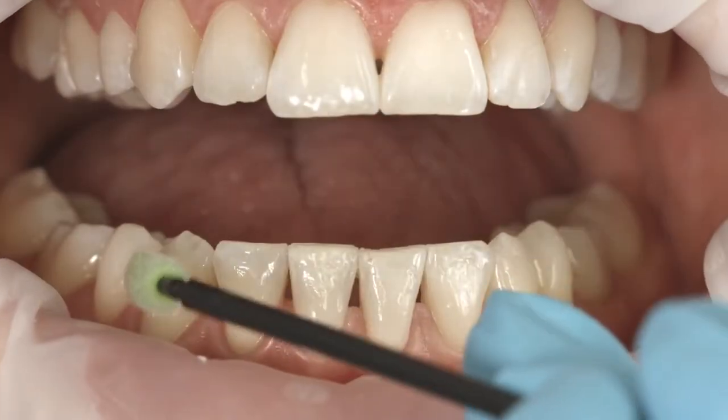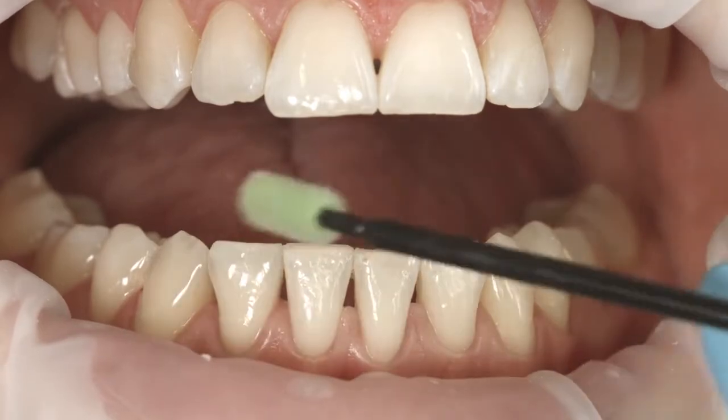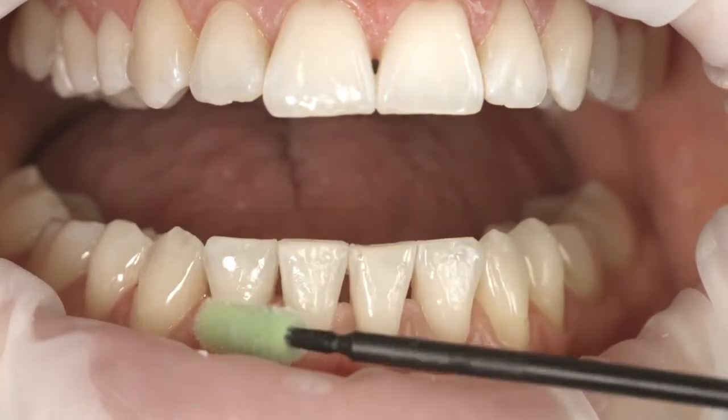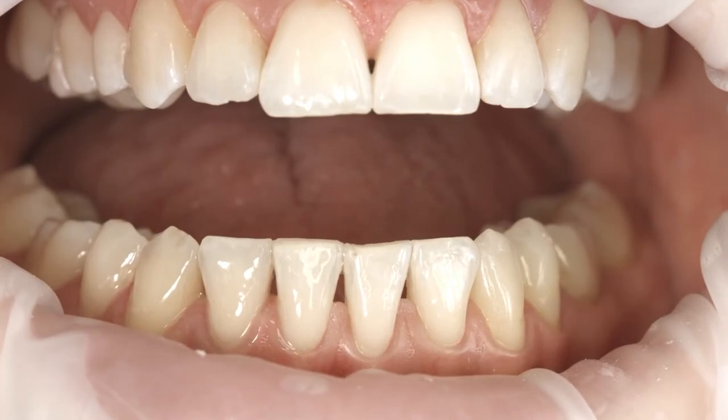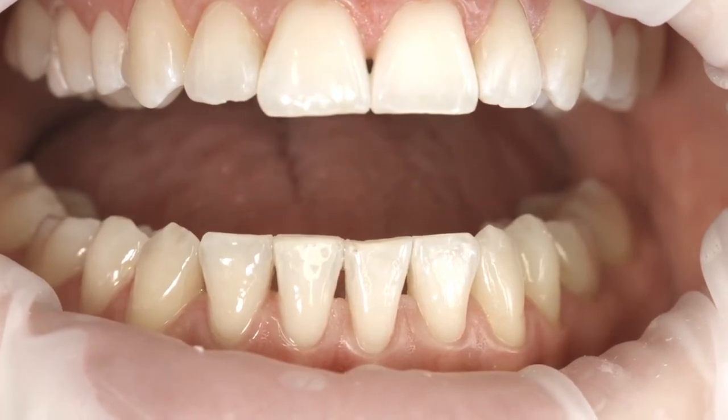If you apply the varnish on many teeth, do one quadrant after the other. A drop from the tube will give you sufficient varnish for one quadrant. Let the varnish dry for one minute.